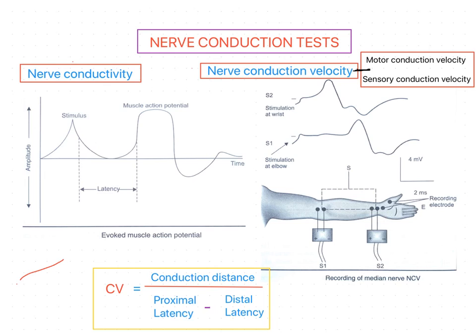If you stimulate at this point on the nerve trunk, the fibers supplied by this motor trunk go to a number of muscle fibers, causing contraction of those muscles. So only distal to the point of stimulation can we find such contractions.